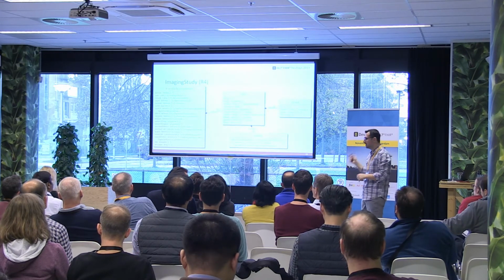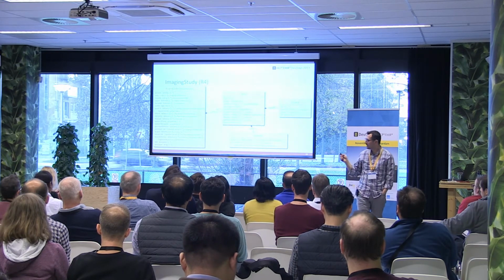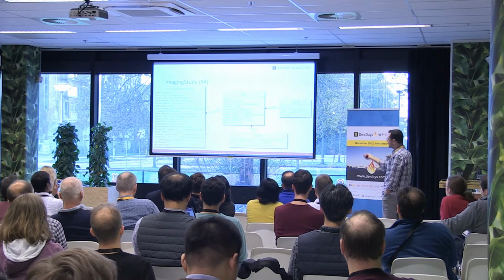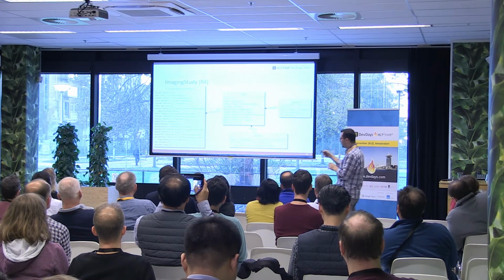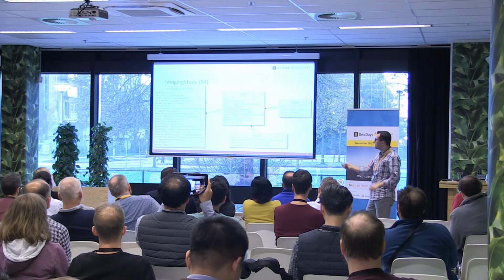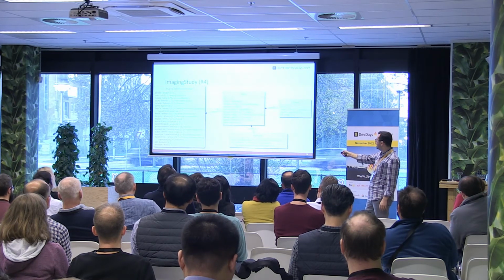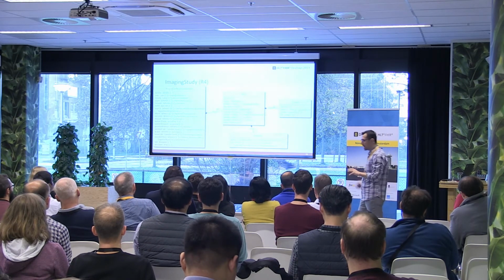Sorry, the slides are online. You can have them later if you like. So looking at FHIR R4, this is what the current object looks like. You don't need to worry about looking at this right now. We're actually going to dissect it in more information. But remember the hierarchy we talked about. Imaging study has a bunch of series, and then the series have a bunch of instances. So it's a similar hierarchy.